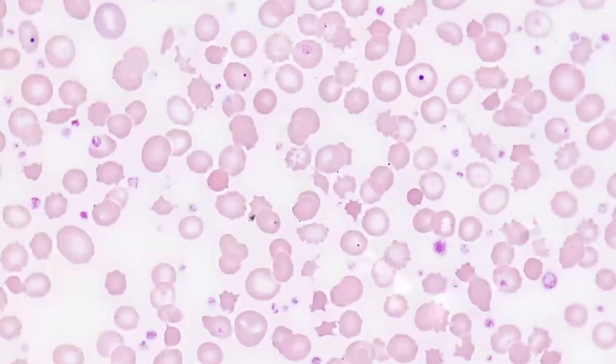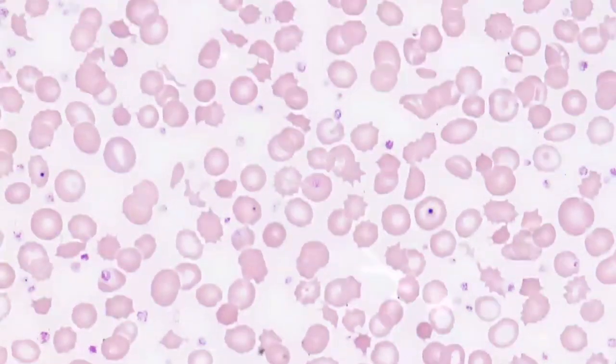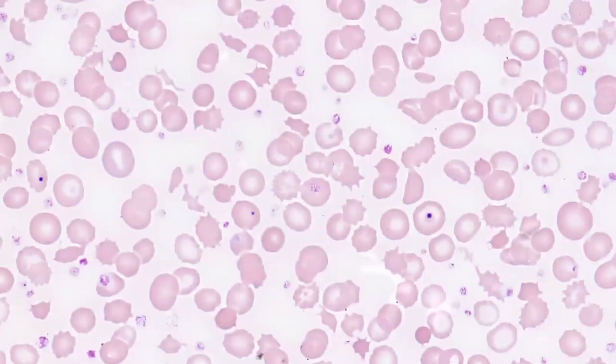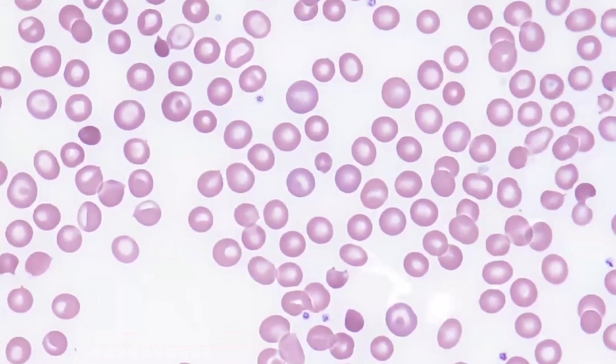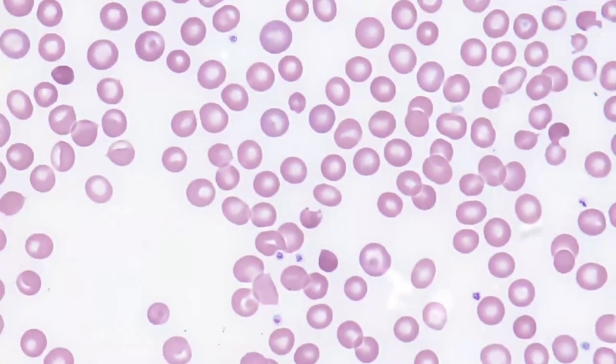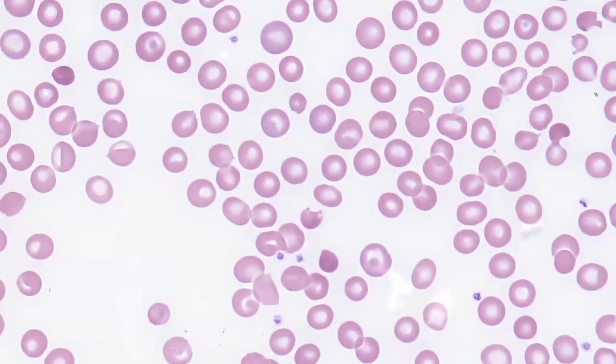In this specific example, we can see evidence of hyposplenism, including here 3 Howell-Jolly bodies, and increased poikilocytosis. And lastly, we'll look at quote unquote bite cells. So at high power, we see rare cells which look as though they've had a bite taken out of them. These are classically related to the removal of Heinz bodies by the spleen.